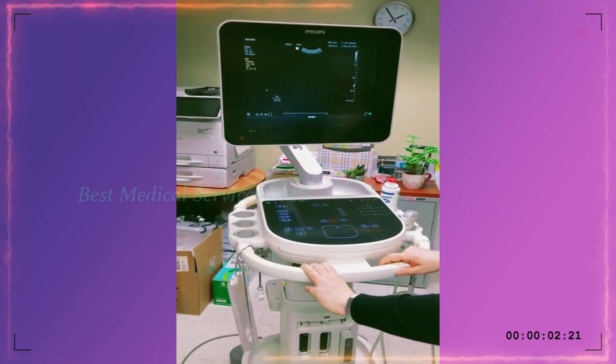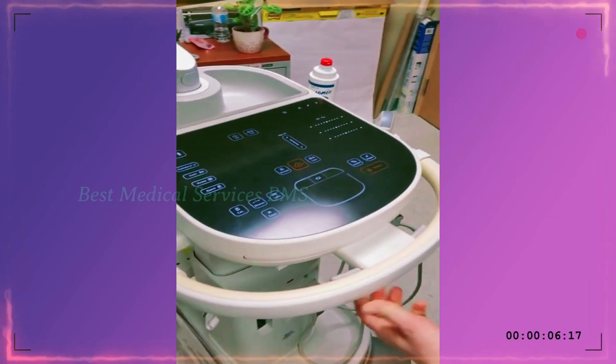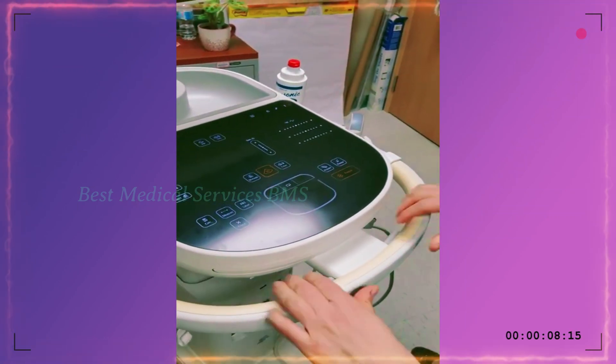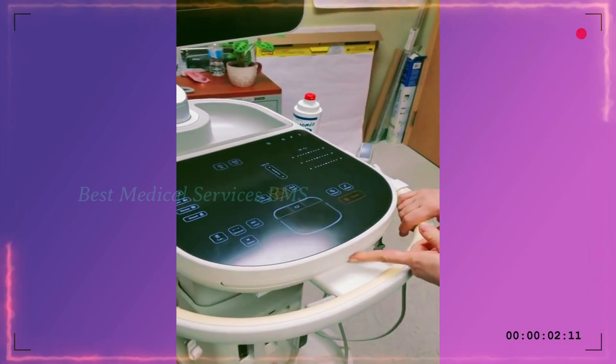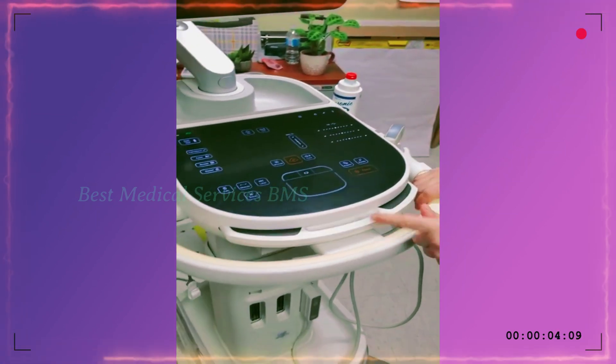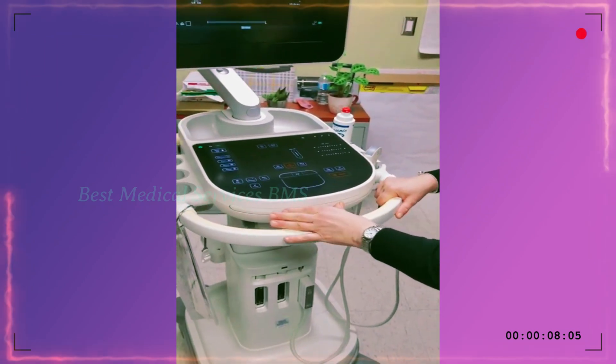The other features of this machine are that it can go up and down. By squeezing these two little buttons, I can move it up and down — so if someone's sitting, they can put it down or up. And if you just press here, the keyboard will come out. These are features mainly that the physicians will be using.